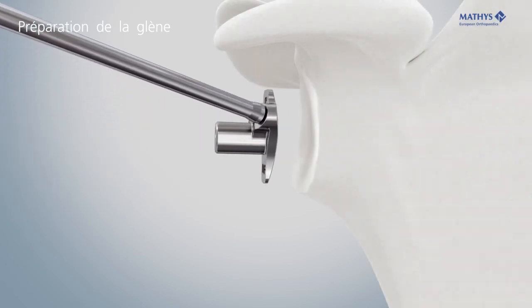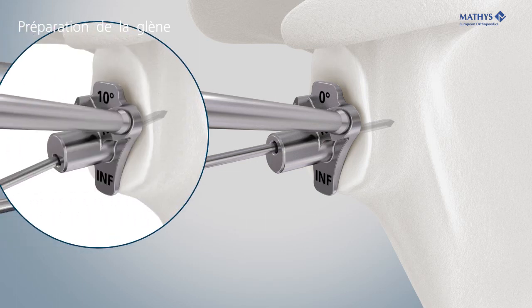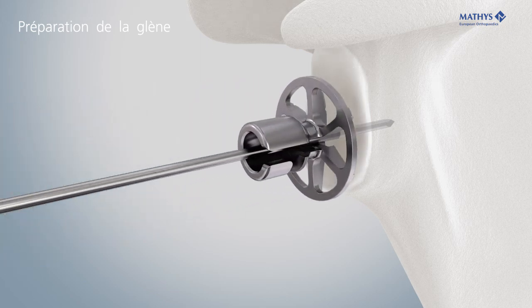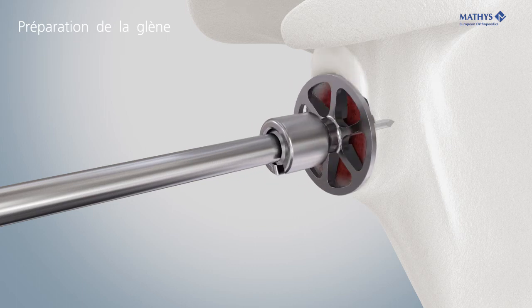Align the K-wire guide with the inferior rim of the glenoid and insert the Kirschner wire. A 0 degree and a 10 degree K-wire guide are available. The modular glenoid reamer is inserted via the Kirschner wire. Ream the glenoid. Keep in the subchondral bone.